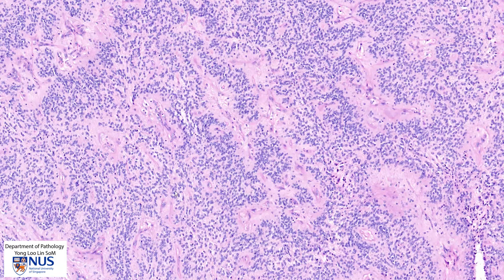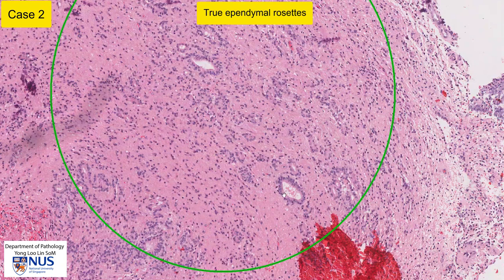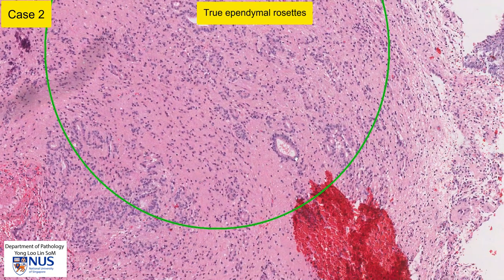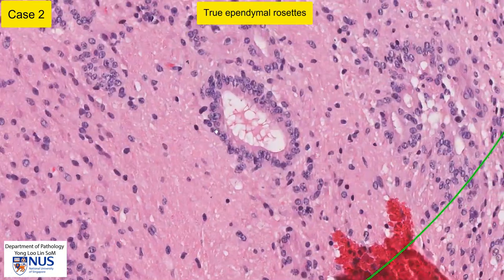This is different from true ependymal rosettes, which may also be seen in ependymomas. Here is an example from a different case — a cerebellopontine angle tumor, also an ependymoma — where the rosette structures are a little bit different. They are almost resembling true glands with a very sharp luminal surface and a proper lumen, as opposed to perivascular pseudorosettes where you have a blood vessel in the center.